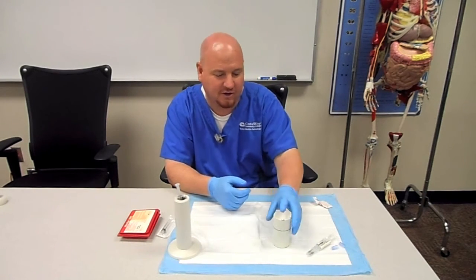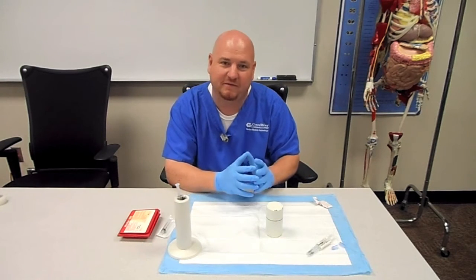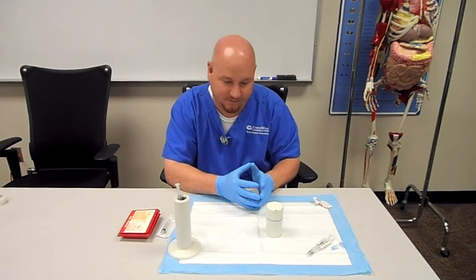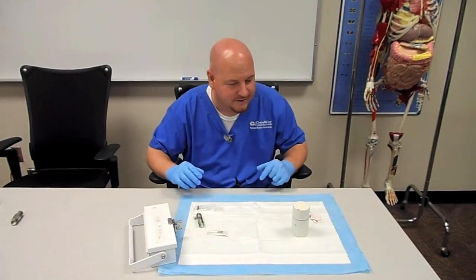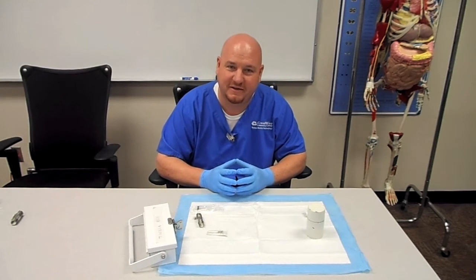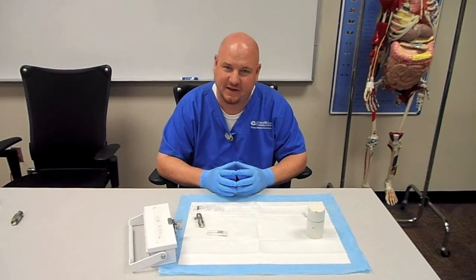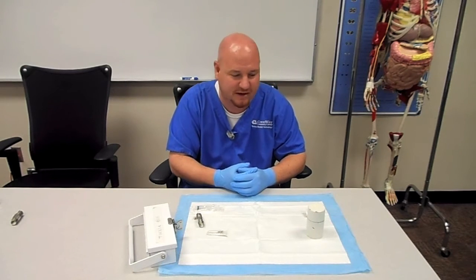Now it needs to sit there incubating for 20 minutes. Every 10 minutes or so you might want to come back and just swirl it, mix it a little bit — again, nothing vigorous, because you don't want to damage the blood cells in there. After 20 minutes, this allows sufficient time for the pertechnetate to diffuse and bind to the stannous ions inside the red blood cells. It's ready to go.